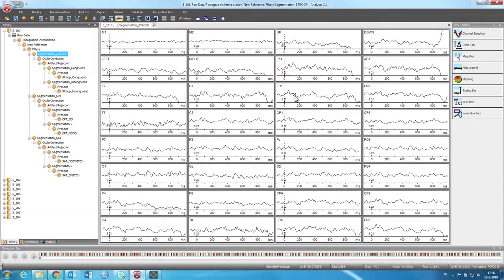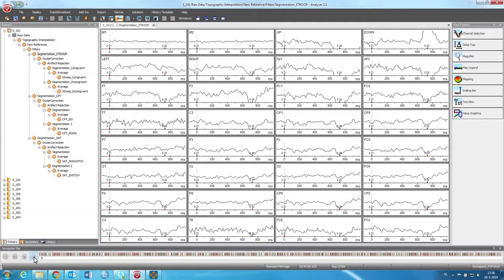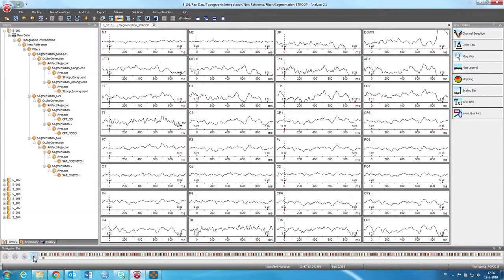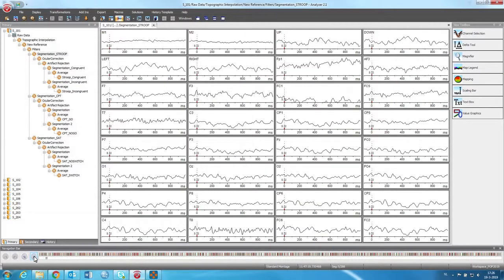So now all the electrodes have the trials at one point. And now if you scroll through the data, you don't scroll through the continuous data but you scroll through the subsequent trials, as you can see.